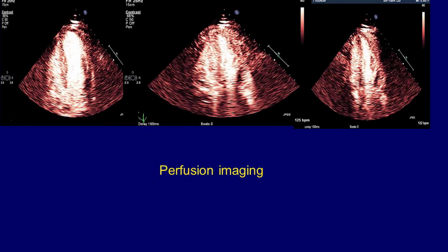And as we do perfusion imaging all the time in most of our patients with stress echo, we did perfusion. If you look at it there, that's the real-time perfusion. So flash, and look at how the septum fills up, and look at the defect at the apex. But this is the triggered imaging. We also do that because you see the perfusion defect much more clearly and see how it begins to fill up. And here in the two-chamber view, you see the same. So we were absolutely convinced there's a subendocardial defect filling from epicardium to endocardium. This is coronary artery disease, and the patient has coronary disease.